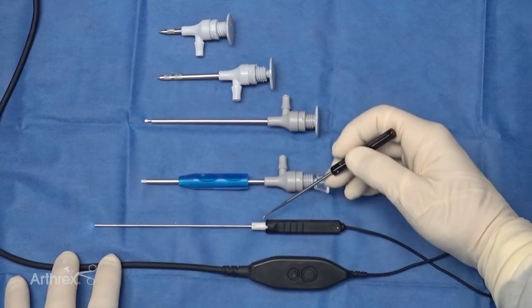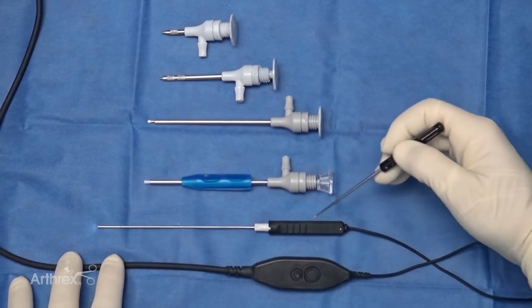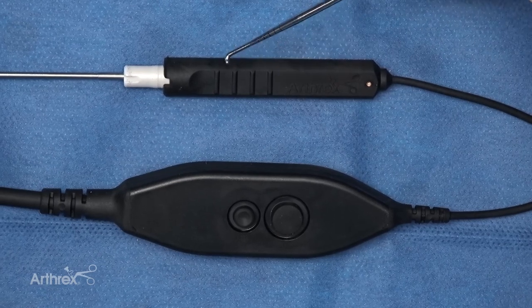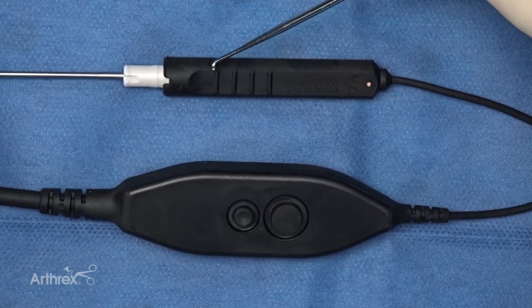Things we're excited about with the new nano needle: the junction allows it to interact with a sheath and not piston. The handle is much more lightweight — we've gotten rid of the redundant plastic and made it very small and ergonomic. We have nice grips on the handle that allow the surgeon to know north, south, and their orientation when scoping.